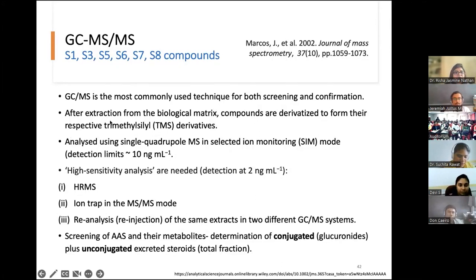Okay, so when they devised this method, they went one step ahead. They found a method that can detect drugs belonging to all these compounds in one single method. Now, such kind of research, if you're interested in research in analytical chemistry, forensic chemistry, or sports doping, etc., you have to work on two things. Firstly, try to find an alternative matrix, okay, a matrix which nobody has worked on, and prove that it is better than urine and blood that is tested in routine analysis.